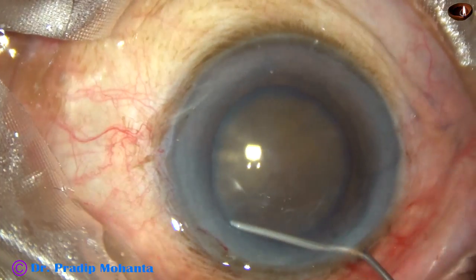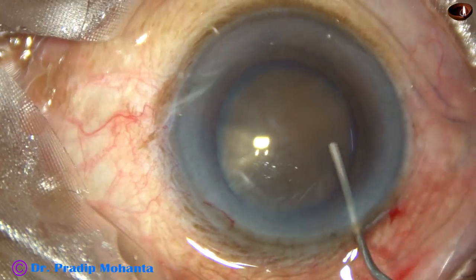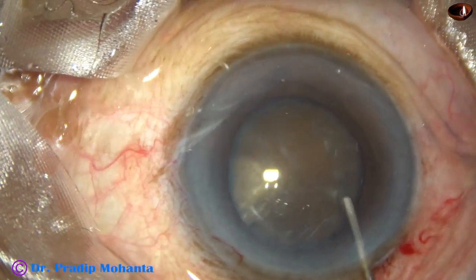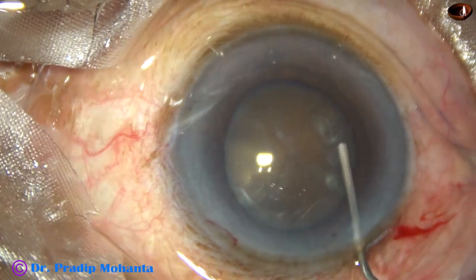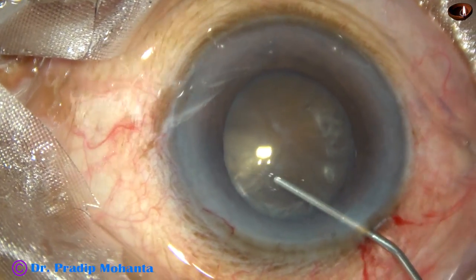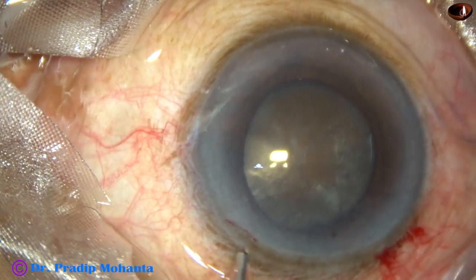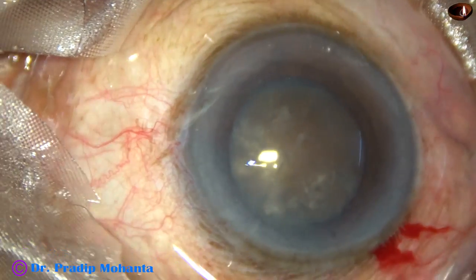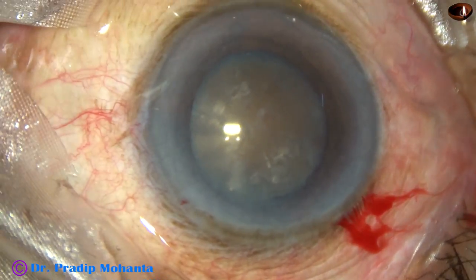Now, hydrodissection. Since we cannot see the fluid wave going from one side to the other side, very gentle hydrodissection is done. Small amounts of BSS are passed just under the anterior capsular rim at multiple points. The nucleus is tapped very gently and then rotated, and now the nucleus is free from the capsule.